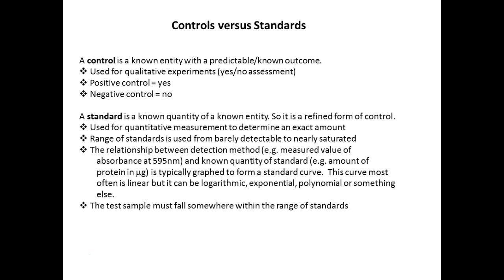Okay. Standards are one step higher, you could say, from controls. And these help us when we want to do quantification, if we want to get a number result. We don't want to know that you're positive. We want to know how positive you are.